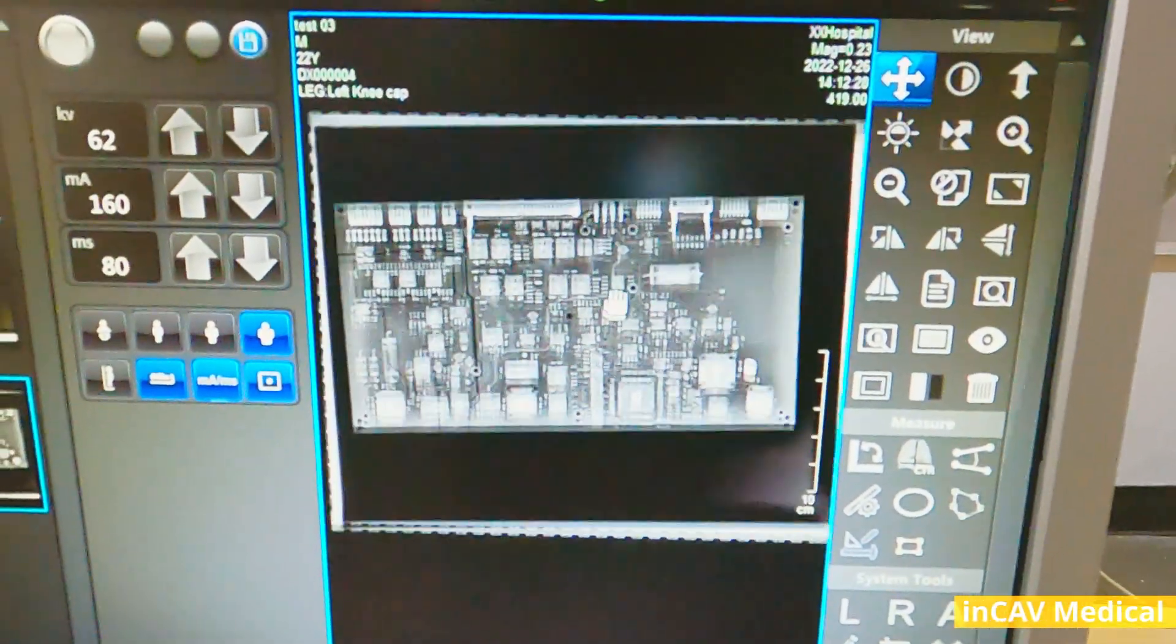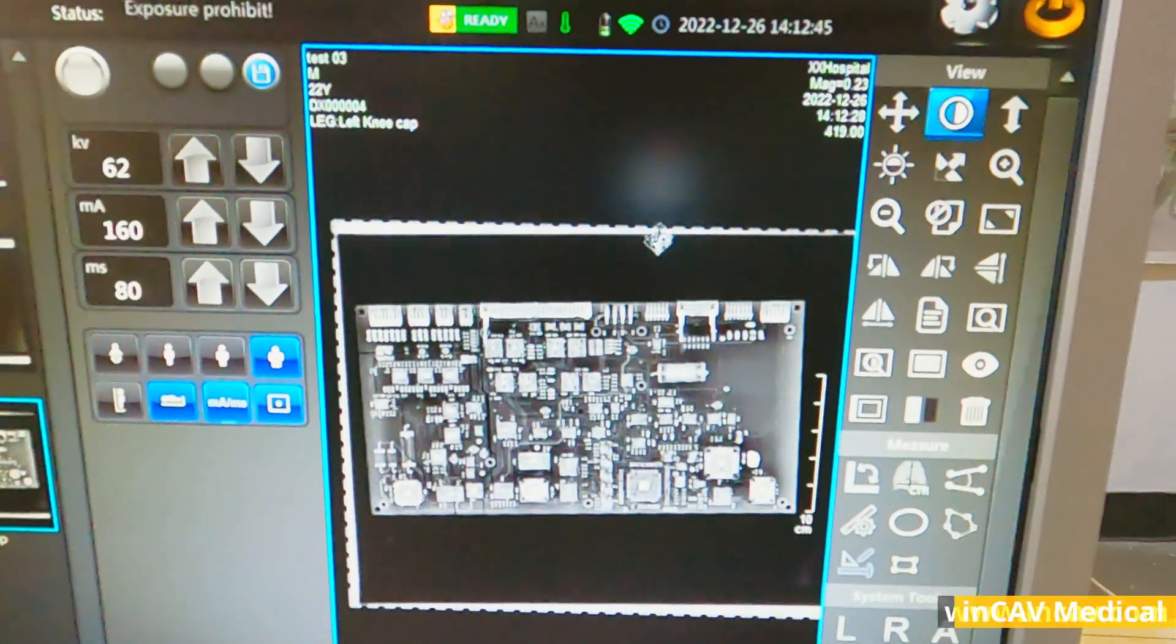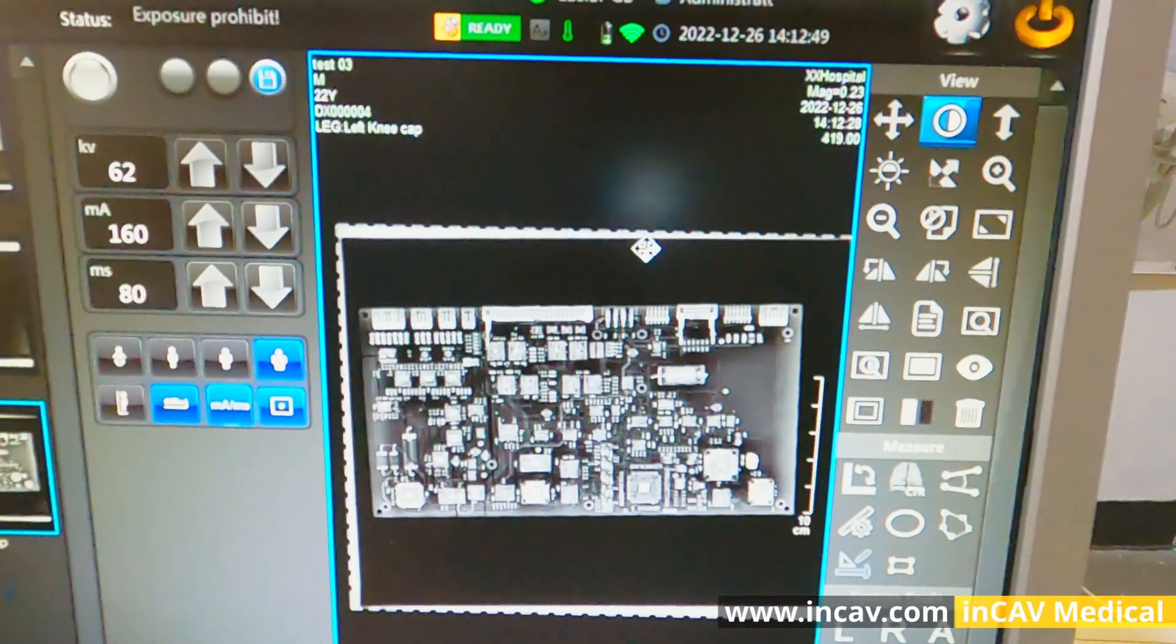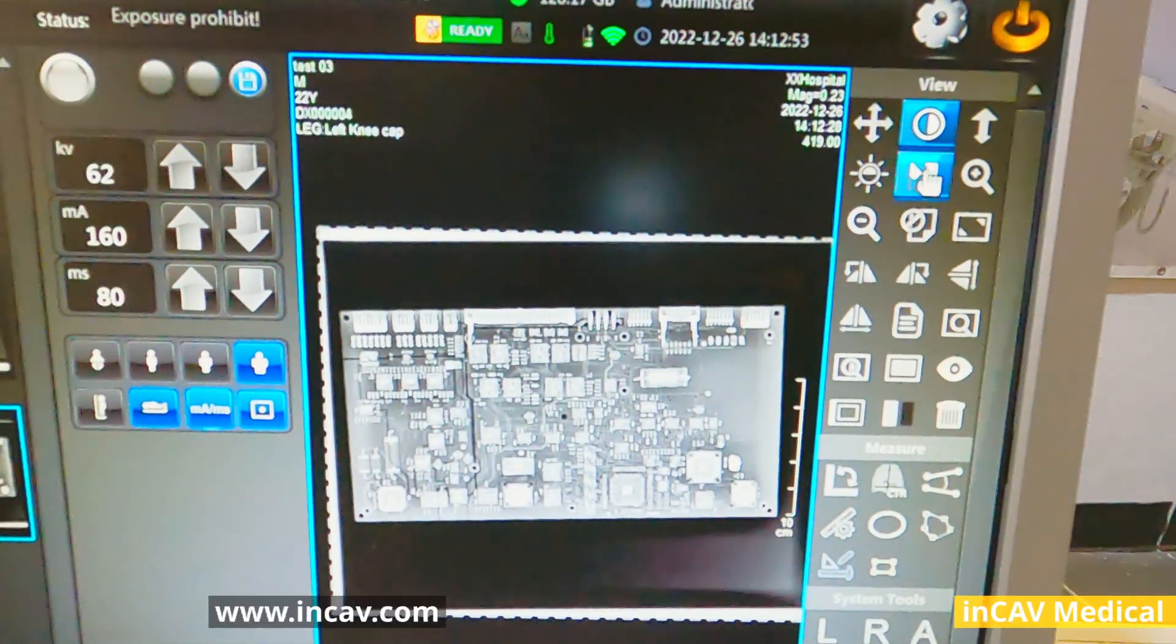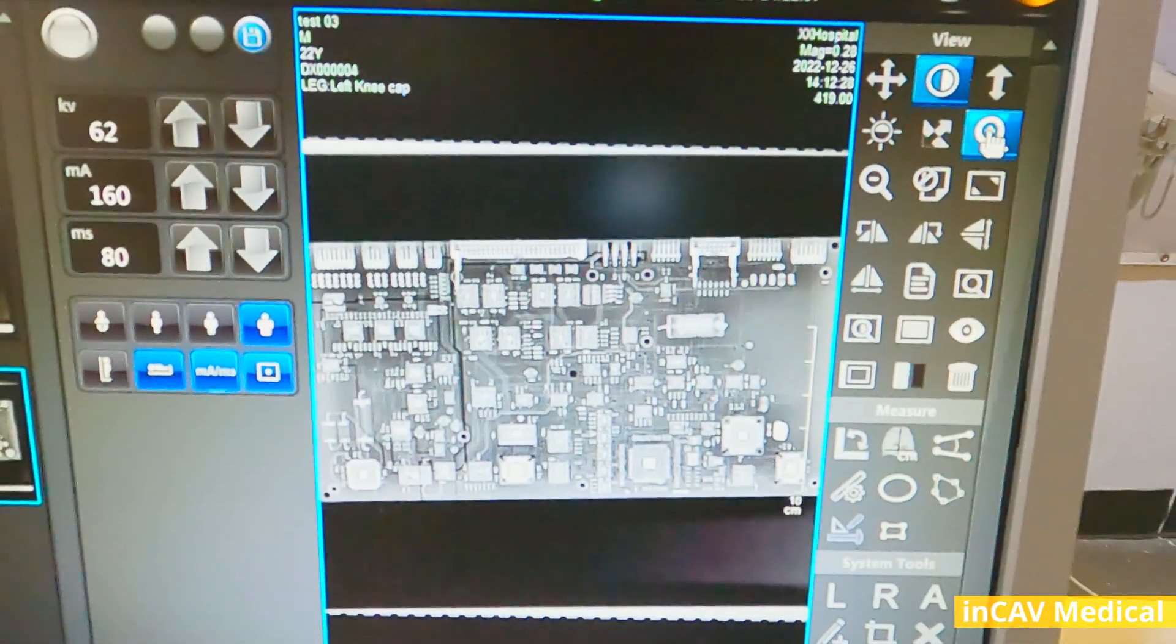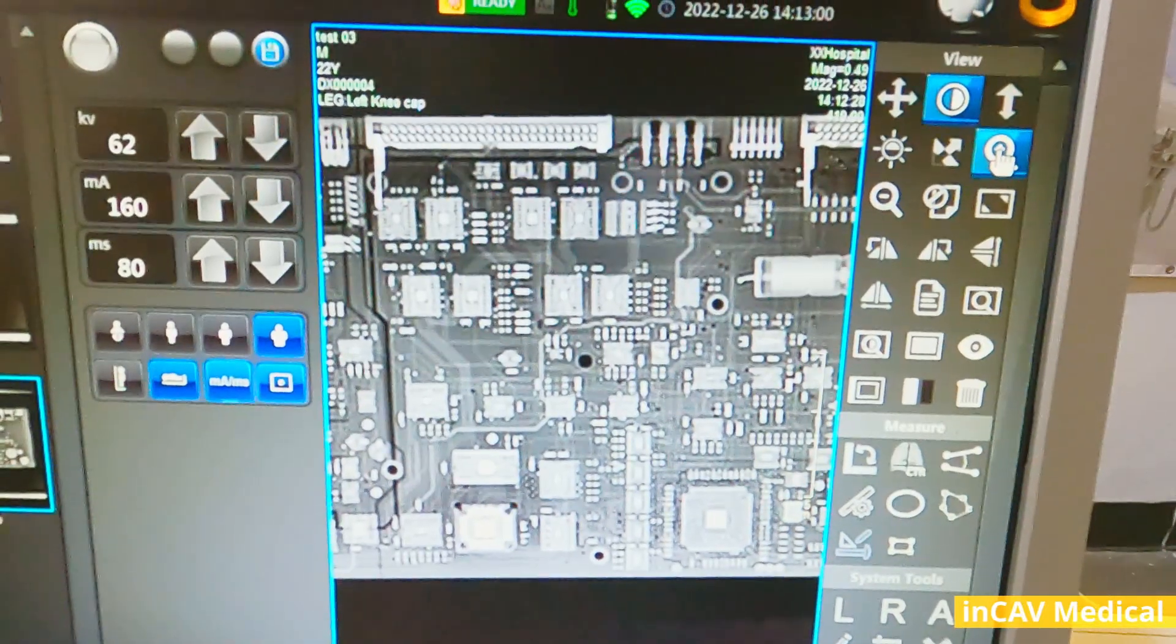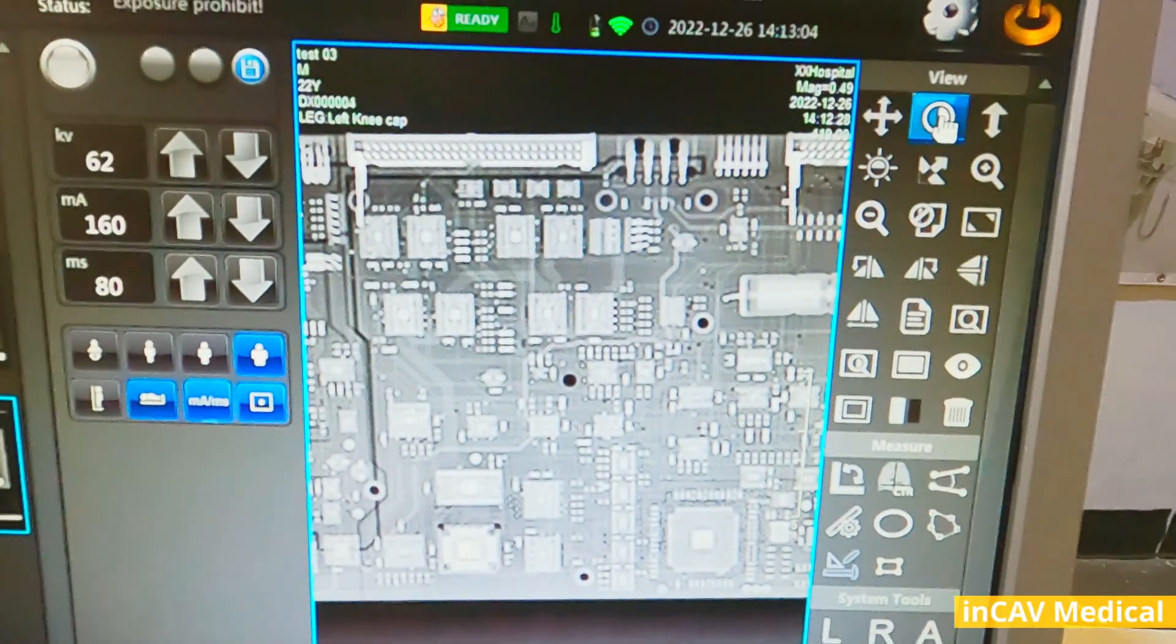We have many tools. For example, we can move the image. We can adjust the contrast, brightness, just moving the mouse over, up, and down. Inverse the image, zoom in or out. It's really easy to use and very intuitive software.